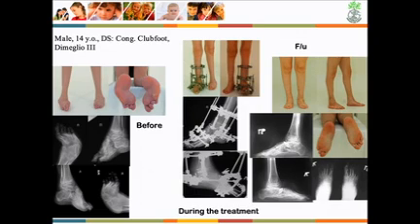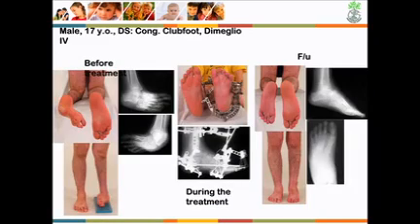In the first surgery we did a little bit of one-moment correction with the Ilizarov fixator, with Achilles tendon lengthening and lengthening of the tendons of the toes. After surgery, gradually full correction, and in the second stage we did triple arthrodesis. We did similarly in the next step after 3 months: we treated the right foot, and in the end we got a good result.